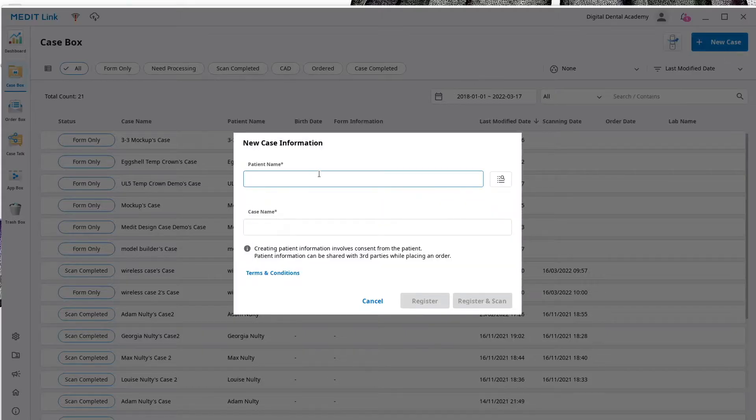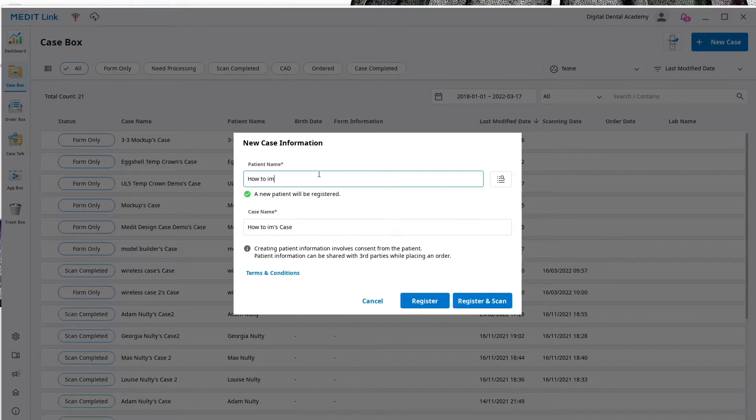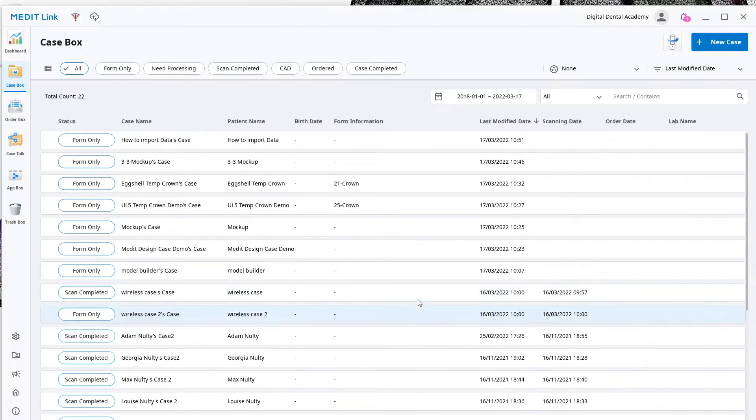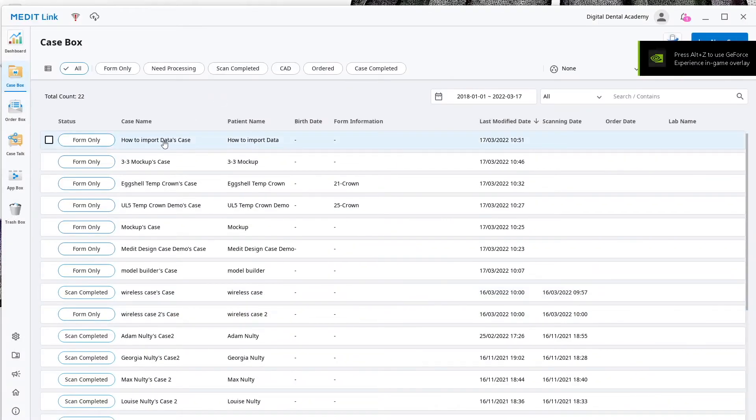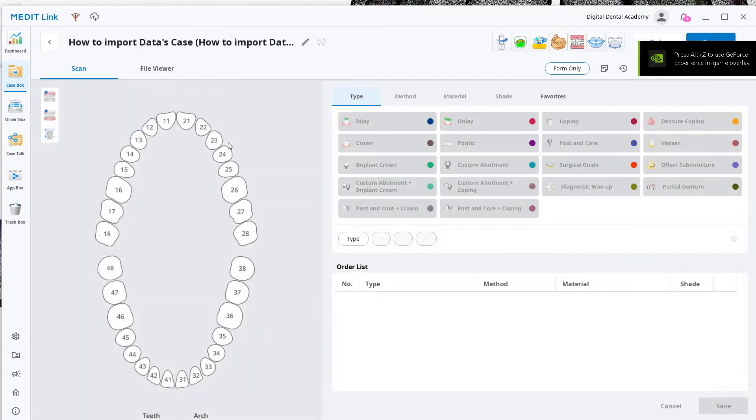All we're going to do is create a new case. I'm just going to call this 'how to import data and register it.' There we go, and I'm going to click on that so the case is opening here.